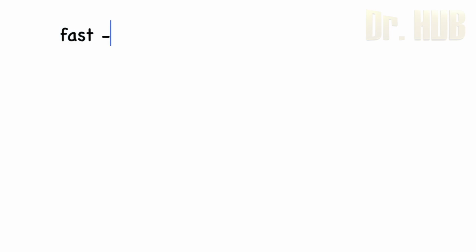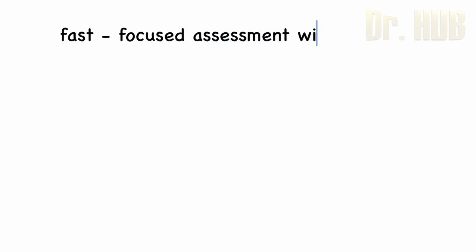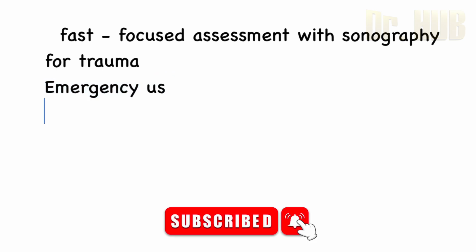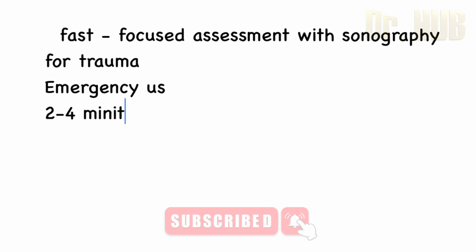FAST. So what is meant by FAST? FAST means Focused Assessment with Sonography for Trauma. So this is the full form of FAST. It is an emergency ultrasound, and it is performed rapidly, in 2 to 4 minutes.